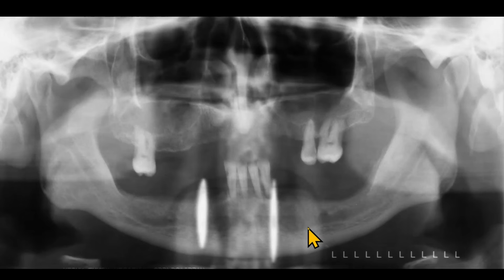So these are metal buttons on a winter jacket. So look for anything that can come out, and this may include a winter jacket or clothing with a zipper or a hoodie with some kind of metal component. So this should have been taken out.